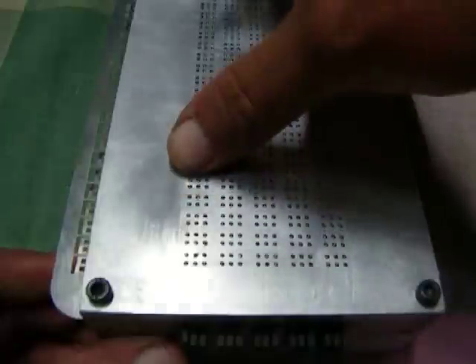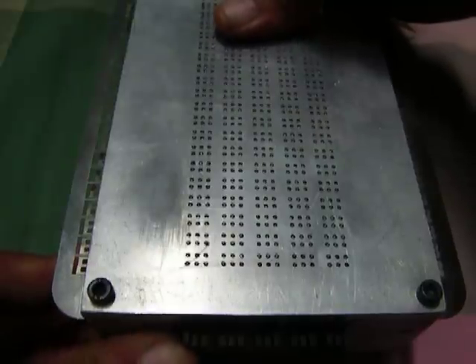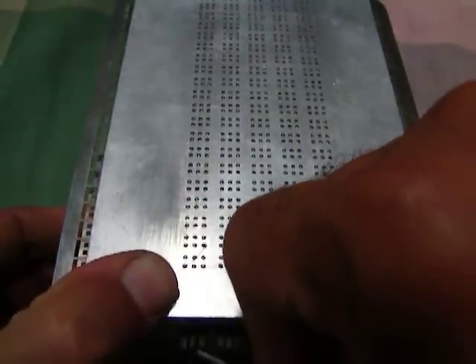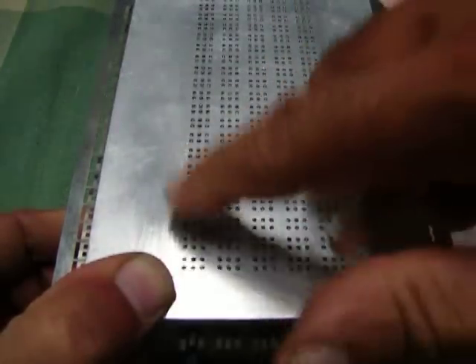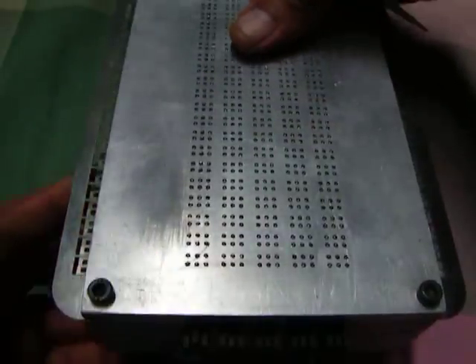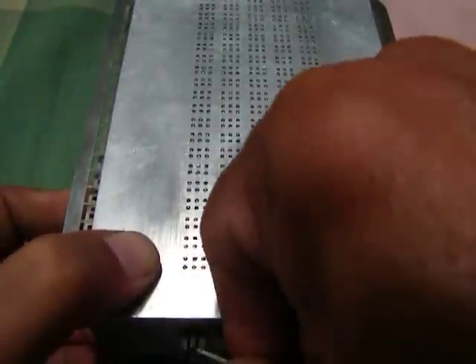The first five cells have absolutely no movement up or down. They're latched shut down. So can you see them? They're just going up, down. I'll do it for the second row. Second row, first five cells, nothing, and you can see the rest of the pins up there. And just drop them again. You can see them all dropping.